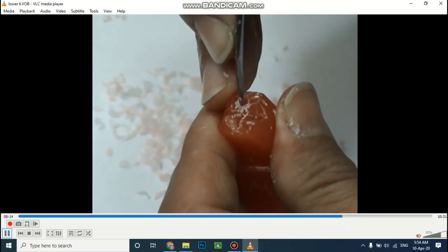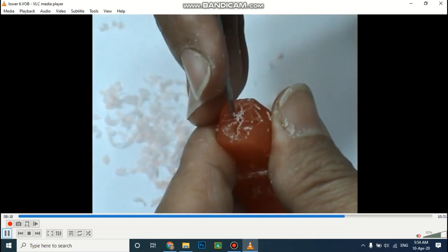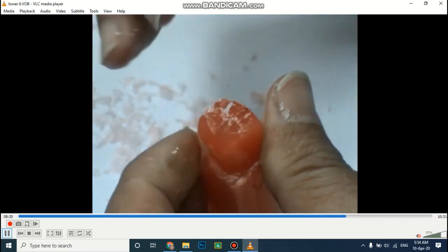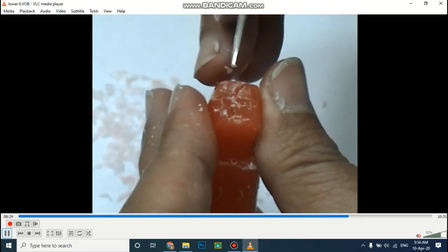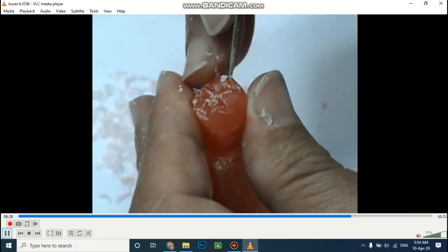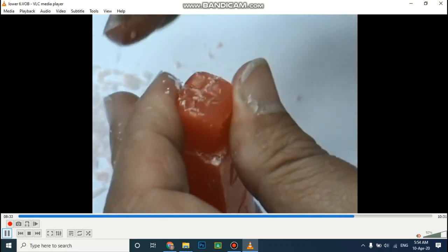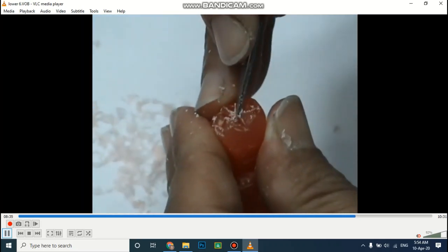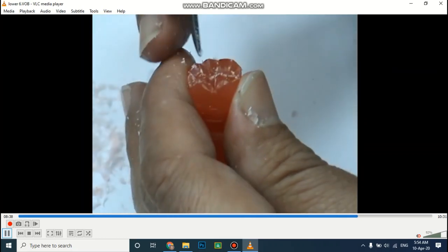Draw the zigzag central developmental groove, communicating it with the lingual surface, creating the lingual developmental groove and 2 buccal grooves, mesiobuccal and distobuccal developmental grooves. From these grooves, accentuation of the triangular ridges occurs, as we see now.